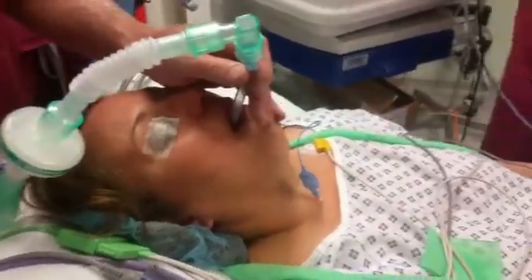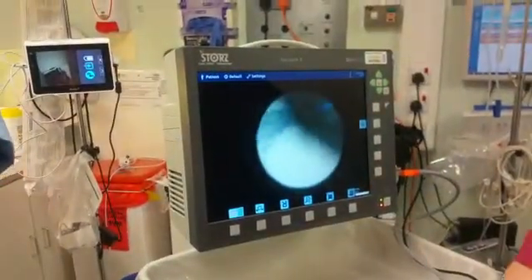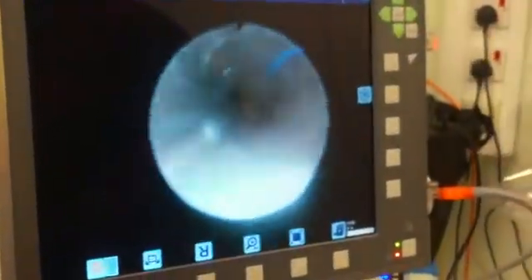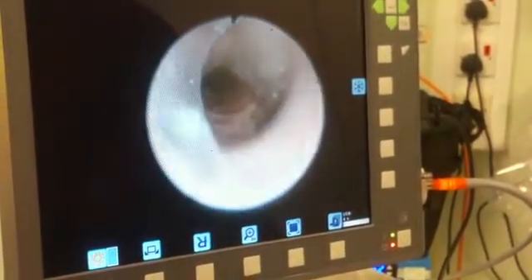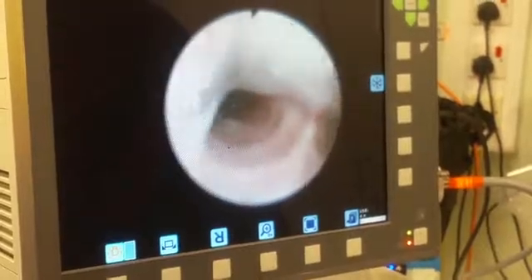If you want to check tube position, you can. Check tube position now. Let's go. Both sides going up and down? Right, so we're right on the Carina, so we come back a bit. There we go, it's nicely above the Carina there. 21 now. There we go, perfect. There's a tiny thing in here.